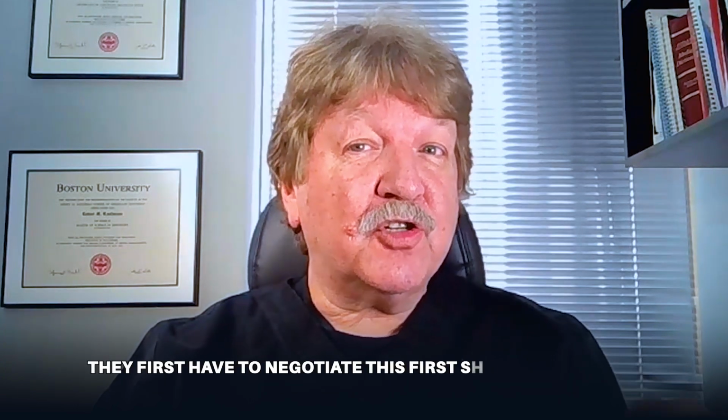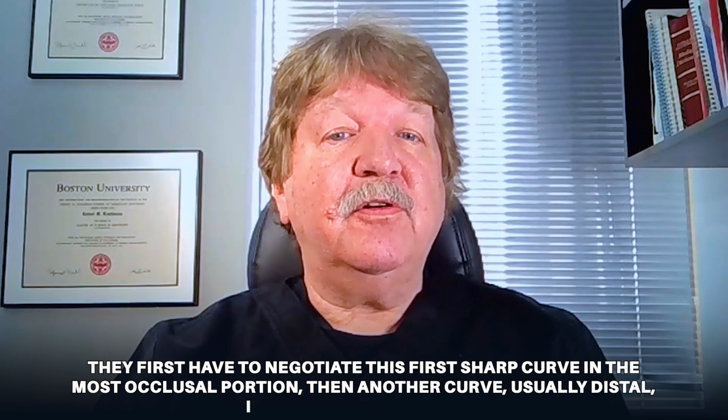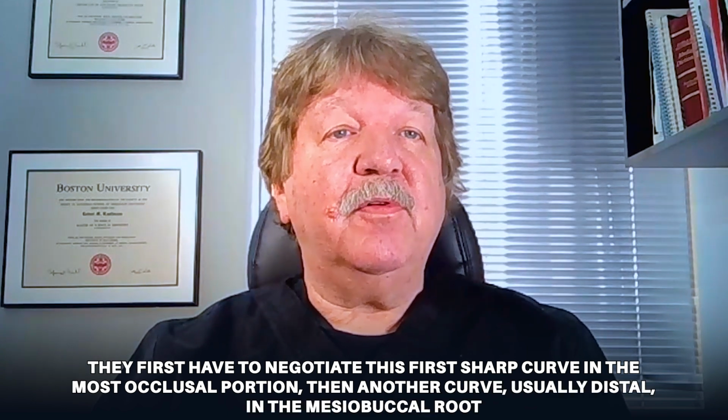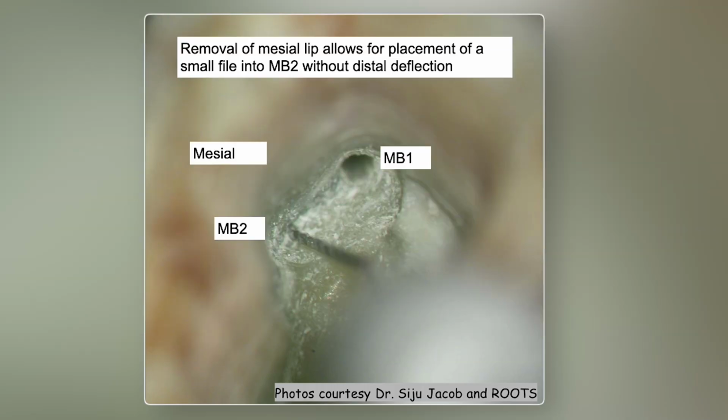This predisposes the instruments to fracture because they first have to negotiate this first sharp curve in the most occlusal portion, then another curve, usually distal, in the mesial buccal root. It's imperative that rotary instruments are not placed into the orifice at this point, because attempting to power through this initial curve can result in fracture of the instrument either in the orifice or deeper down. Small burrs such as Mueller burrs, Muntz burrs, or ultrasonics are used to remove this mesial lip.